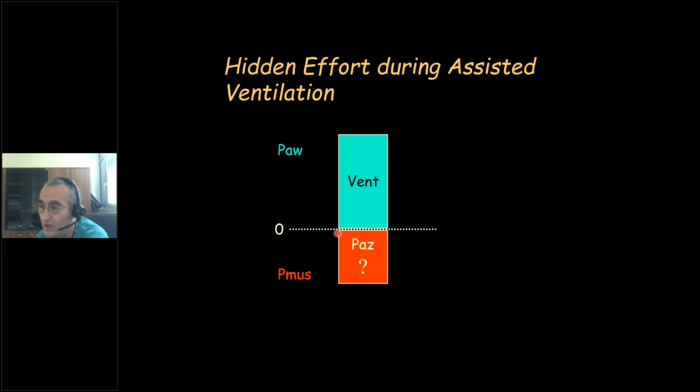We do not know the pressure developed by the respiratory muscles of the patient. But I think you share with me the idea that even on pressure support, on every lung, in every condition, there exists a driving pressure, that is the pressure applied to the alveoli during the tidal volume. And the pressure is the sum of this one plus this one. To know this pressure, you should use the esophageal pressure.